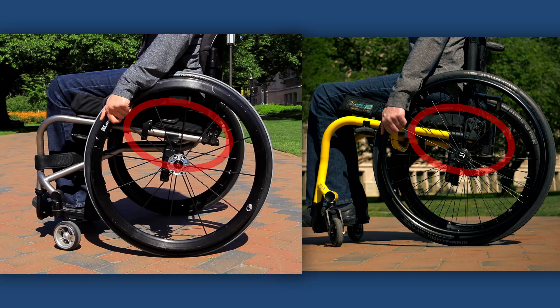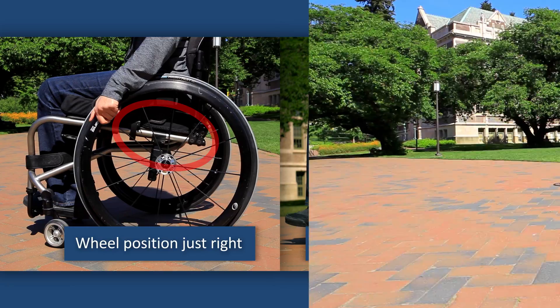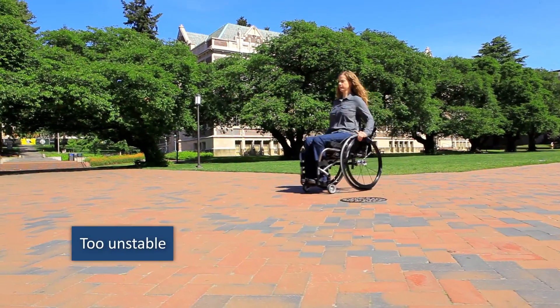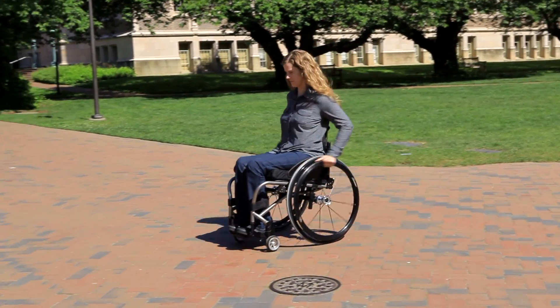Instead, the wheels should be as far forward as possible without making the wheelchair too unstable. An unstable wheelchair tips back into a wheelie too easily, which can make pushing your wheelchair stressful, tiring, and potentially dangerous.